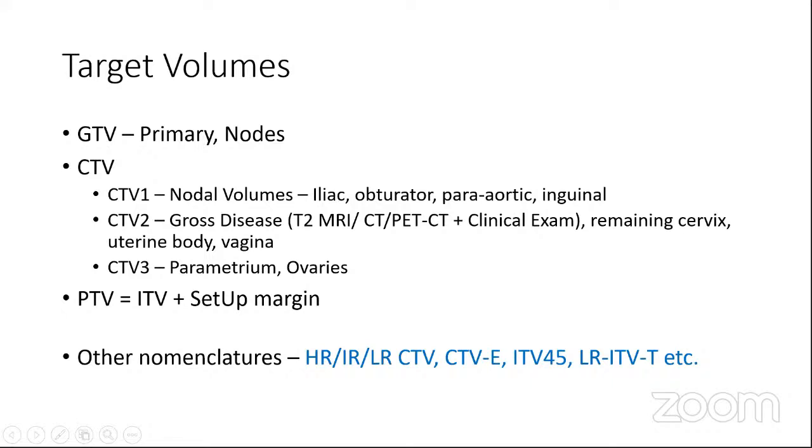CTV is the one where there is a lot of contention, a lot of controversies, and that's why we need to have consensus. And of course, lots of groups have come up with different consensus. If you look at the kind of people who have given consensus, we have guidelines from the RTOG group, and guidelines from the Japanese group.